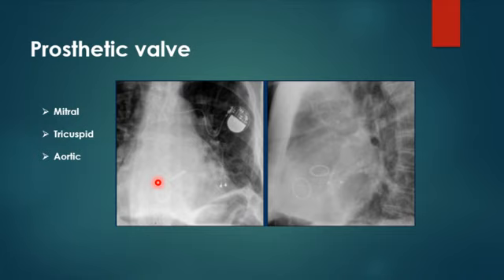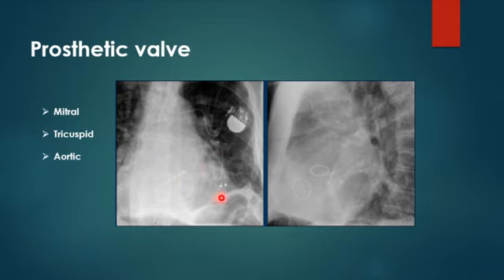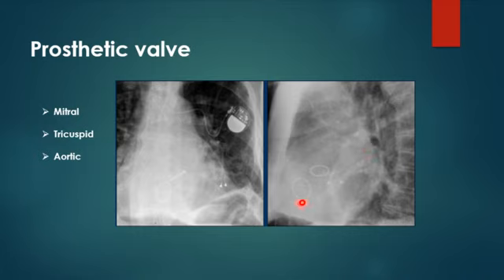This is another example of a patient with three prosthetic valves. Drawing a line from the left atrial appendage to the right cardiophrenic recess: this patient has cardiomegaly and incomplete inspiration so the diaphragm overlies the heart slightly. The transversely oriented valve with its orifice toward the aorta is the aortic valve. The valve below the line is the mitral. The most rightward, most inferior valve — often overlying the vertebral bodies — is the tricuspid. On the lateral view: above the carina-apex line is the aorta, below is the mitral, and the most anterior and inferior is the tricuspid.